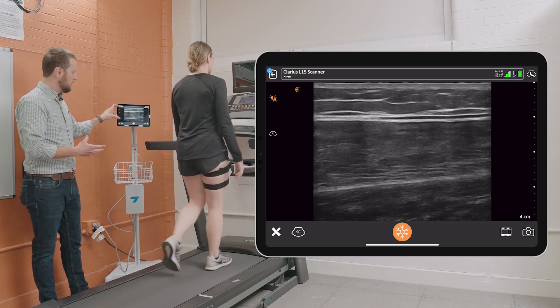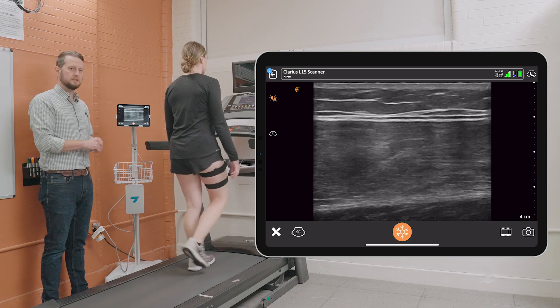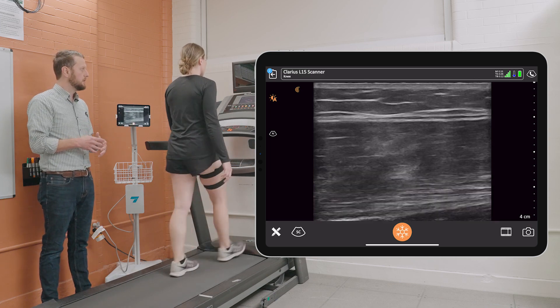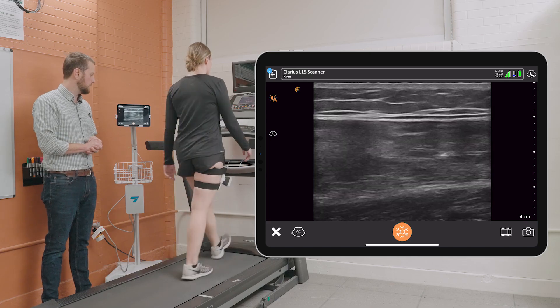So now we can take that video and analyze it to look dynamically at how that muscle and how the fascicles within that muscle are changing and responding to the loads that are required during this walking trial.